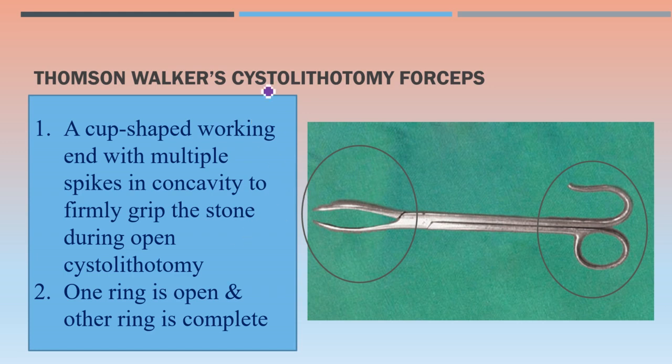Thompson Walker cystolithotomy forceps — you can see there is a cup-shaped working end with multiple spikes in the concavity, to firmly grip the stone during open cystolithotomy. Cystolithotomy means removal of stones from the urinary bladder. Here, one ring is open and the other ring is complete — that distinguishes this instrument. Thompson Walker cystolithotomy forceps is used to remove stones from the urinary bladder.